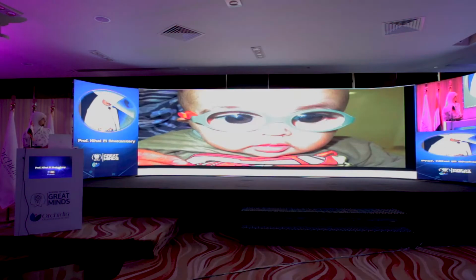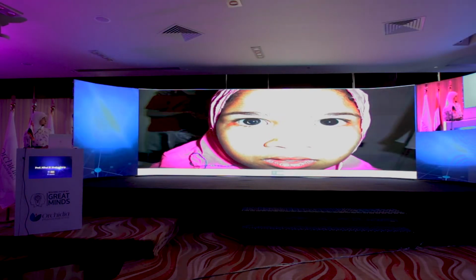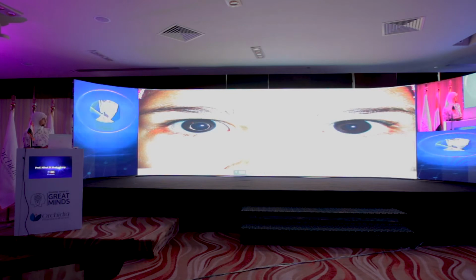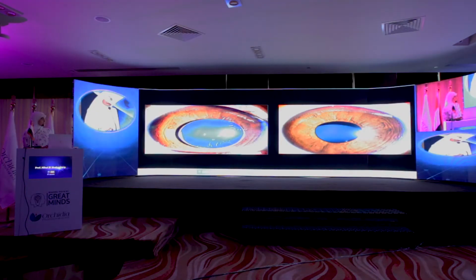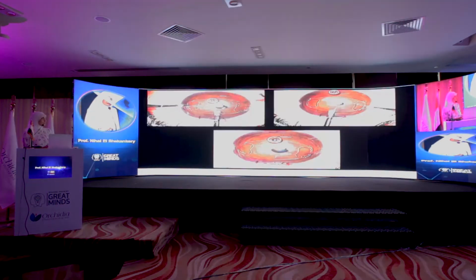Here an eye before the surgery with shallow anterior chamber, and here immediately after surgery with deep anterior chamber, and then we fit the children immediately with aphakic spectacles. This is another example of a child with bilateral microspherophakia. One eye dislocated into the anterior chamber and the other is subluxated, here immediately after surgery.